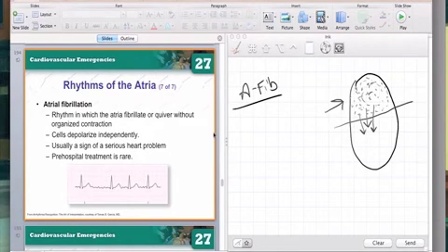And Afib is the only rhythm that we talk about which is irregular. There is no rhyme or reason. So when you look at your EKG here, you're going to notice that you have no discernible P waves. This almost looks like artifact on your isoelectric line. It's flopping all around. And if I were to actually take out these QRS complexes, it would almost look like VFib. So I have fibrillation waves, and my R to R intervals vary between each one. People live every day with Afib.